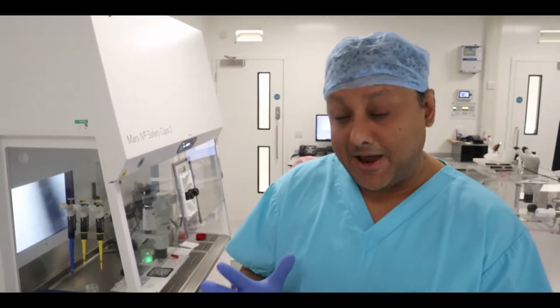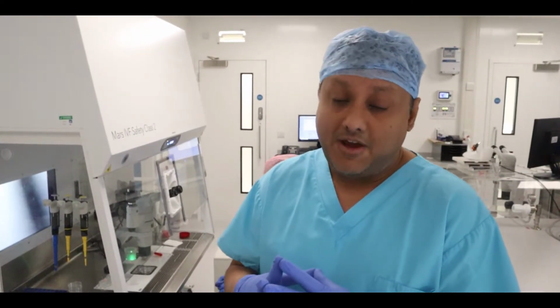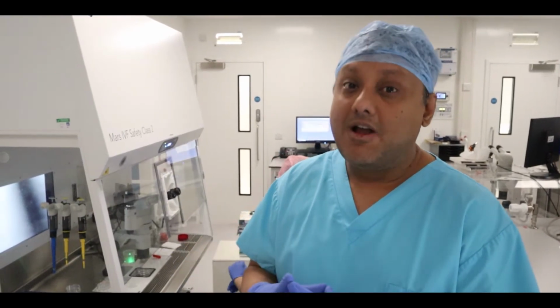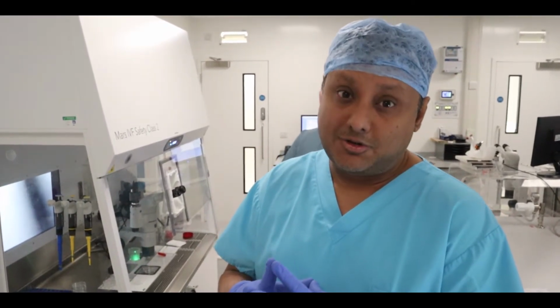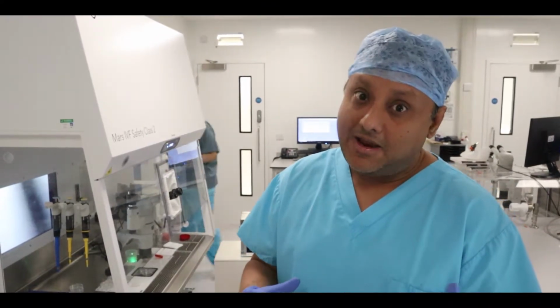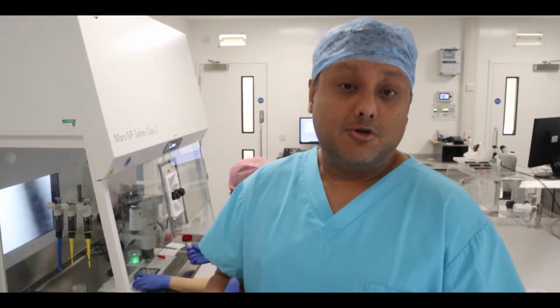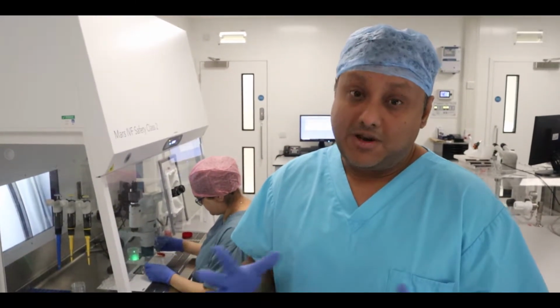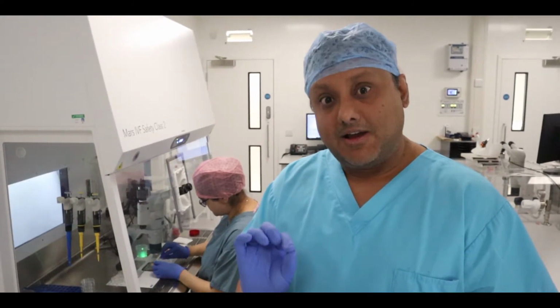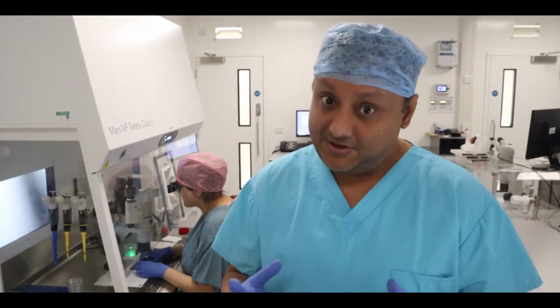Just to give you a bit of background about this patient, she's 45 years old. She's had several IVF attempts in the past. We're expecting around 2 eggs today. She's managed to have 2 follicles. Both those follicles look quite good. Now again, we will be talking in a separate video about how we get the patients ready to the point of egg collection. But today she's got 2 beautiful follicles which are going to be punctured by the gynecologist to extract the fluid, which should hopefully have the egg in there.